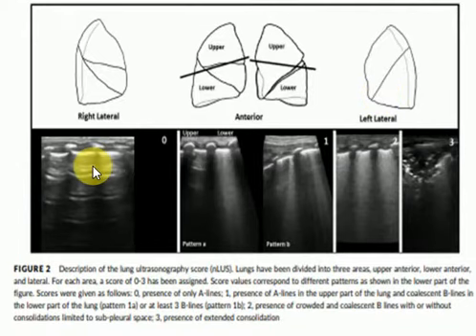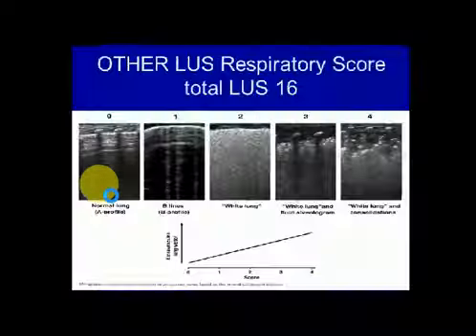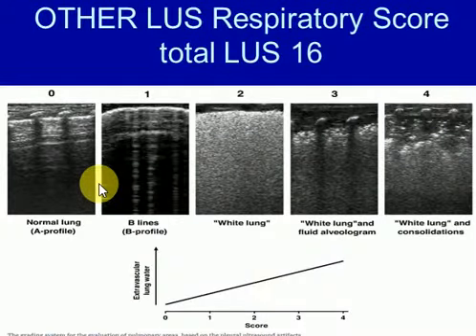The same score. We'll divide the lung into upper and lower by a middle level line with lateral view. Actually, we have another score dividing the lung into 4 zones, not 6 zones. He divided all anterior, left and right is 2 zones, and all posterior, left and right. We make the score from 0 to 4. So the maximum score here is 16.